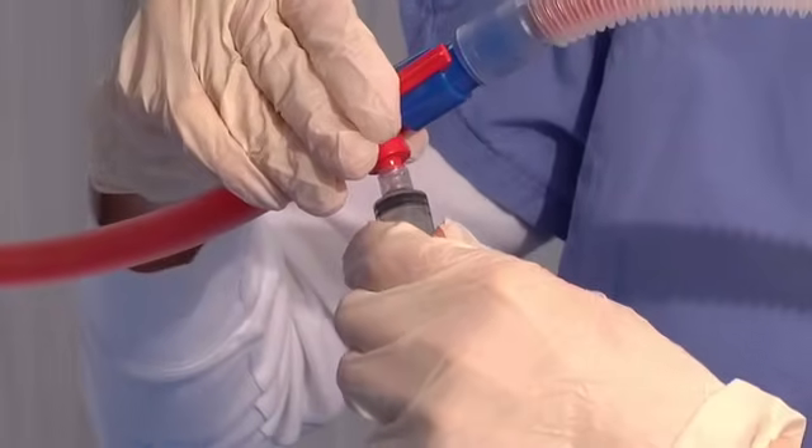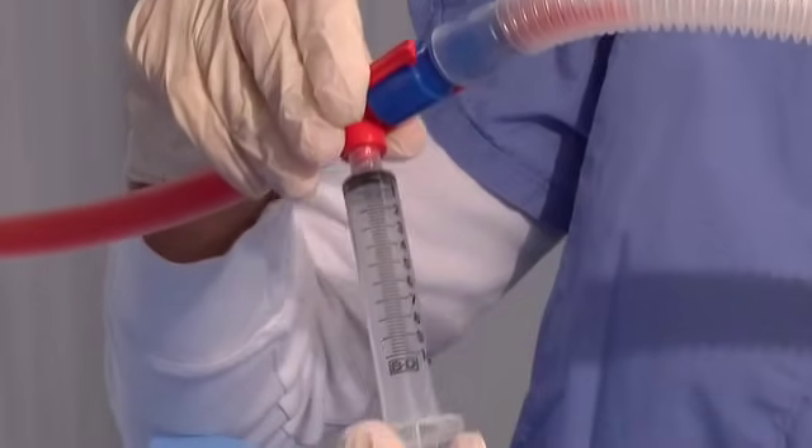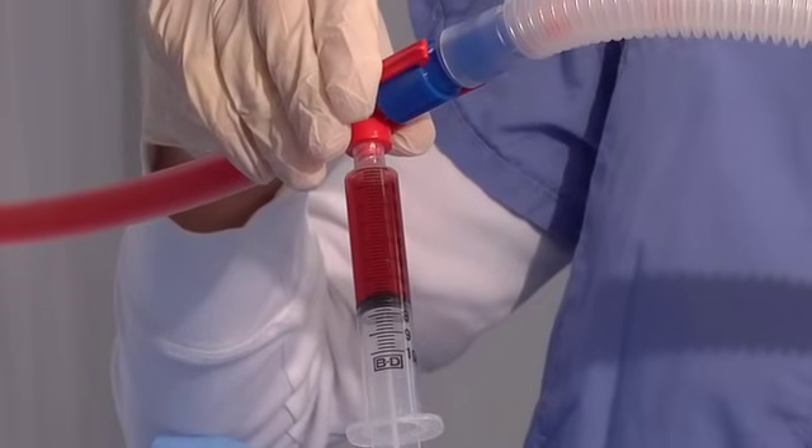Rotate the red and blue connector to where the connector is in the down or inverted position. Use a standard Luer-Lock syringe for withdrawing samples. No needle is required.